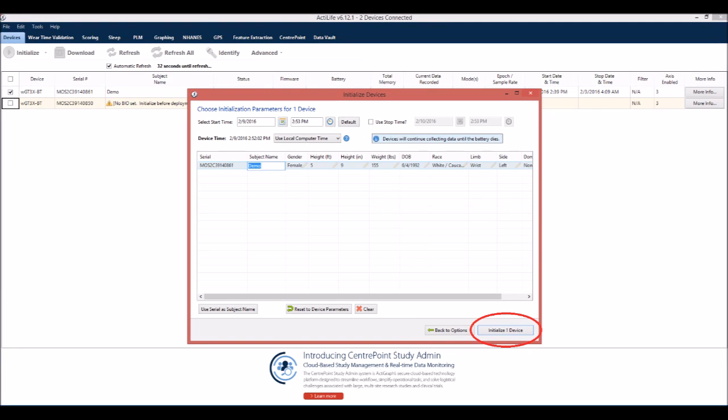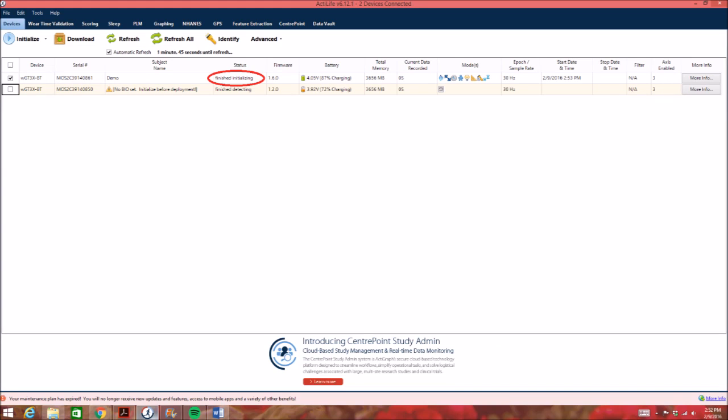Select Initialize One Device and a progress bar will indicate when initialization is complete. Once it is complete, unplug the monitor and replace the USB cap.